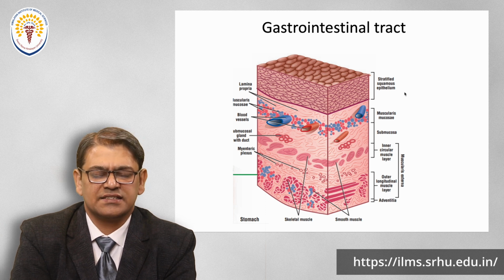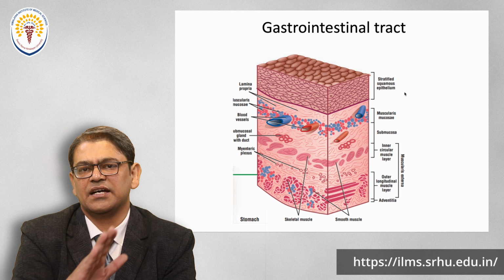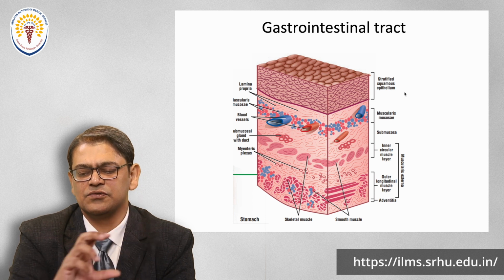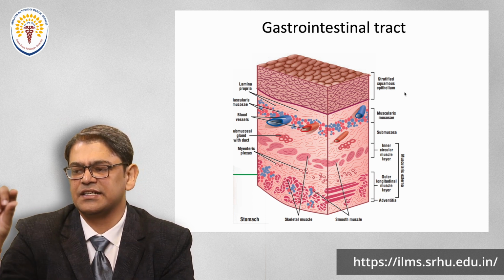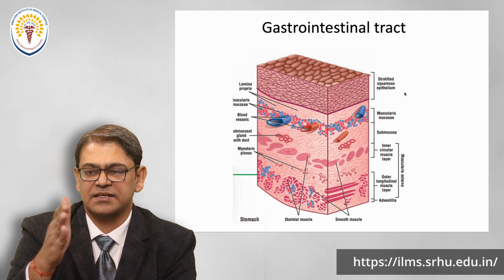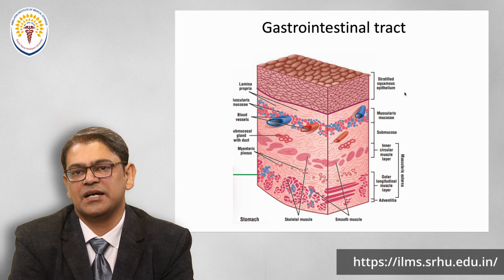That is the first thing. Second thing, in the GIT food is running, right? And food has many components. For it to flow smoothly, we need intermittent presence of mucus cells. So columnar cells, and then many mucus cells. That is the pattern we see in the epithelium.